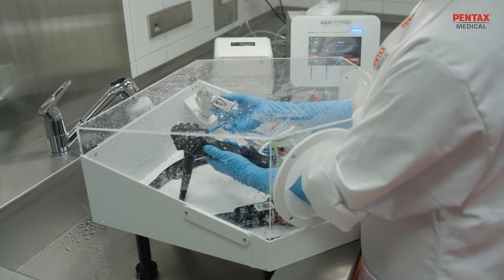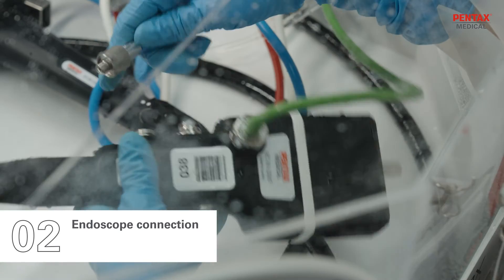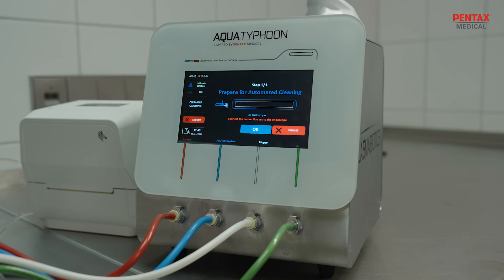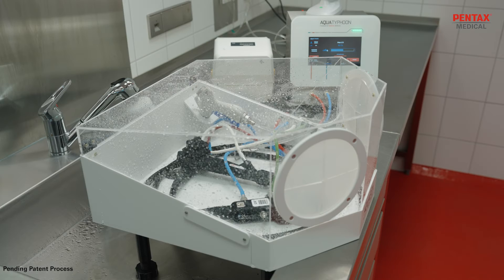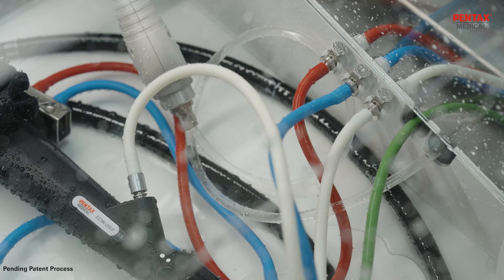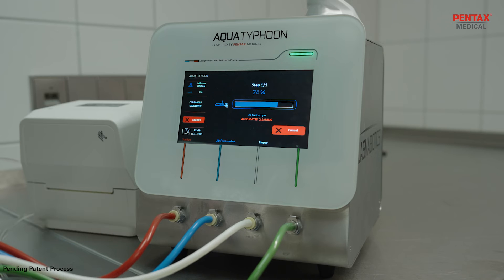The endoscope is connected to Aqua Typhoon following the color-coded connection set. Then the operator starts the automated step of the cleaning cycle. The specifically developed process combining only air and water enables the removal of soil and ensures powerful cleaning of all endoscope channels, including the non-brushable ones. The ultra-fast automated cleaning cycle lasts between 2 and 7 minutes, depending on the endoscope type.